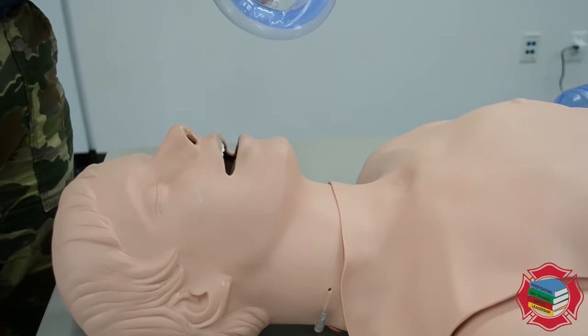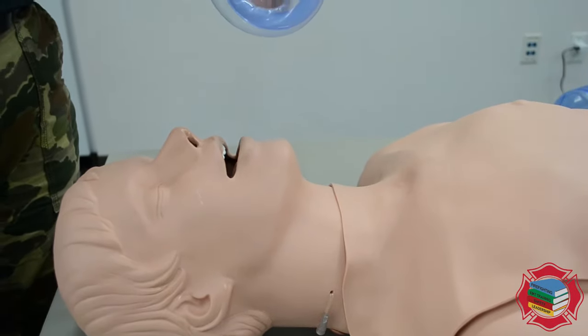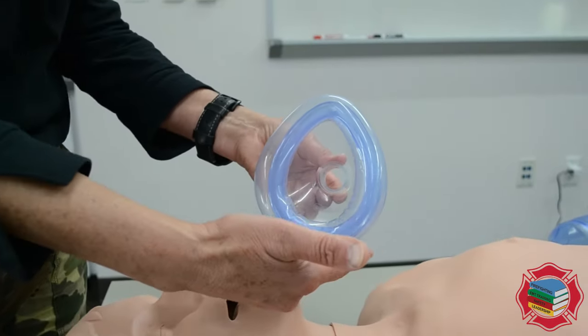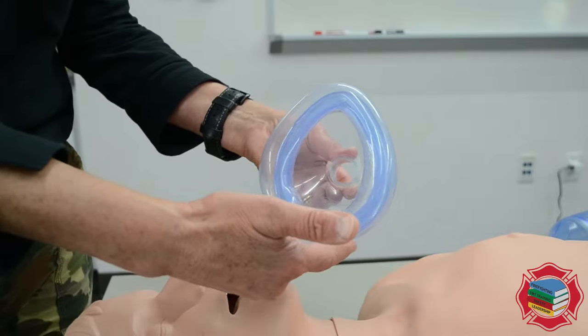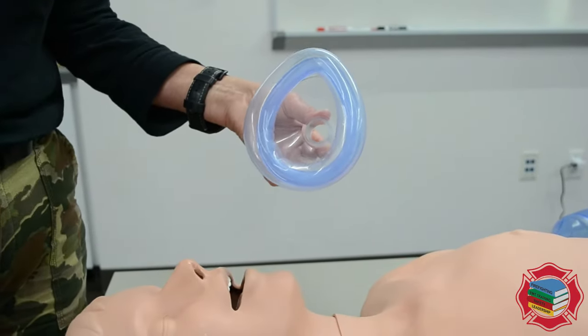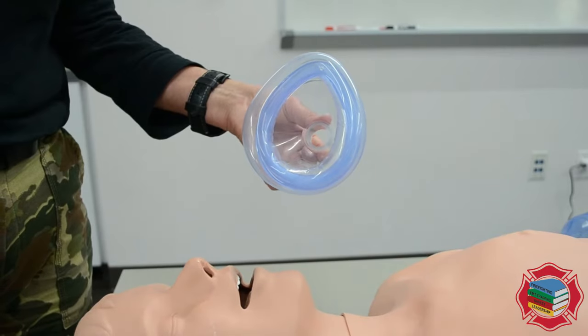Here is your mask. You'll notice that there is a part that goes over the bridge of the nose — that's like the apex of the mask — and then there's the flatter part that goes at the cleft of the chin.